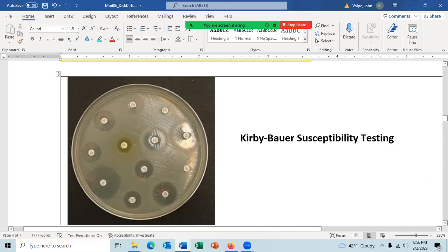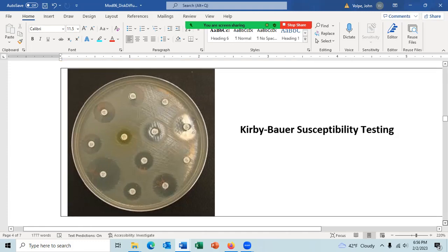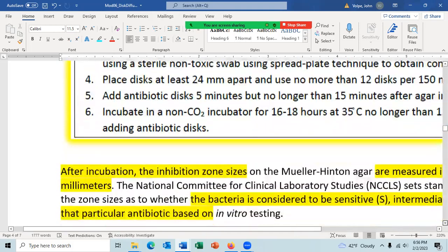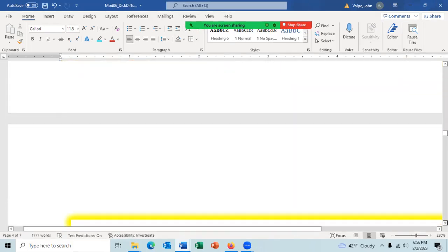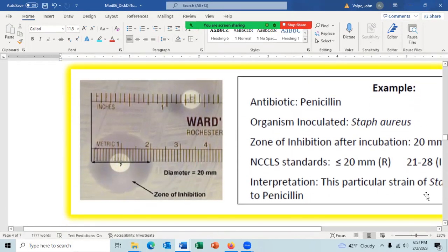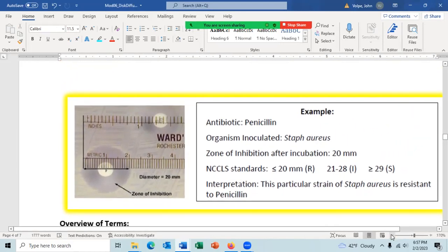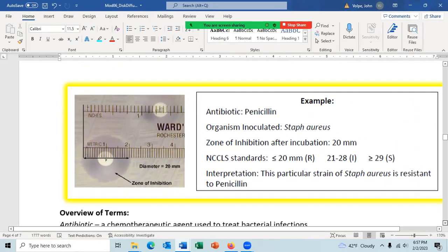And that is taken into consideration by the people who make this chart. Let me come down to the chart for Staphylococcus aureus. Okay. I think penicillin G is one of the smaller antibiotics, but I'm not 100% certain about that. All right, any questions about that?